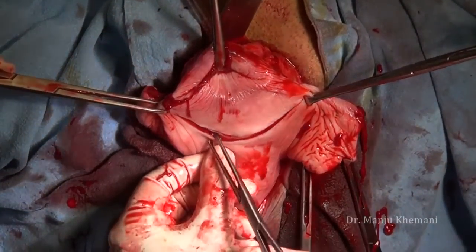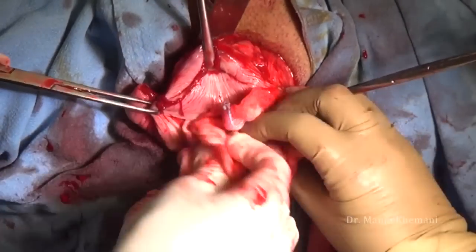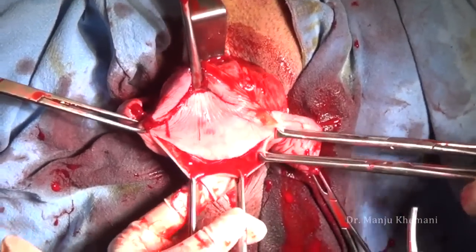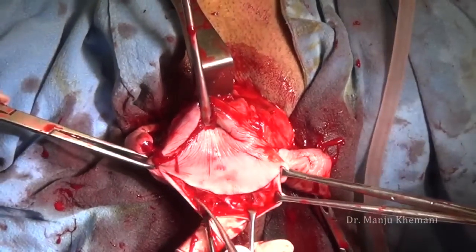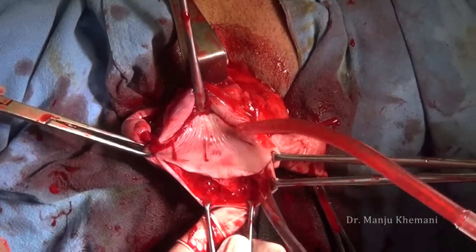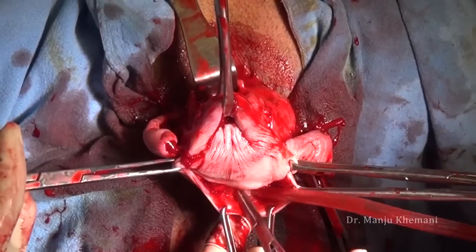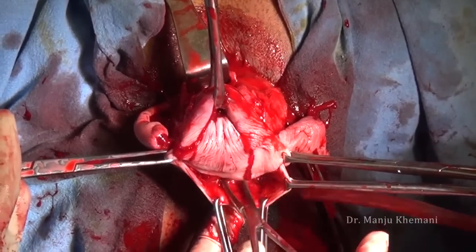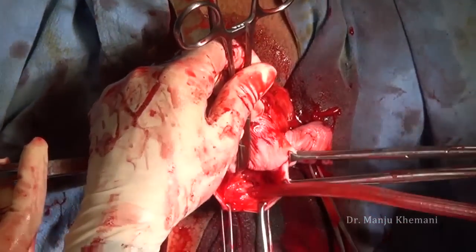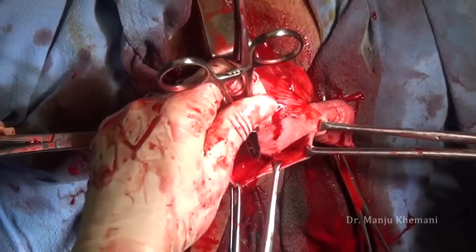Now, how to open the posterior peritoneum: make a cut posteriorly while holding the cervix up on the posterior lip. This is the same warfarin case, hence the bleeding is more. Use the scissors to cut the fascia. After separating it, you will start seeing the peritoneum being reflected from the cervix to the vagina. Catch hold of it, palpate it — make sure no other structure is included — and once you are sure it is peritoneum, make a bold cut and your posterior peritoneum will be open.